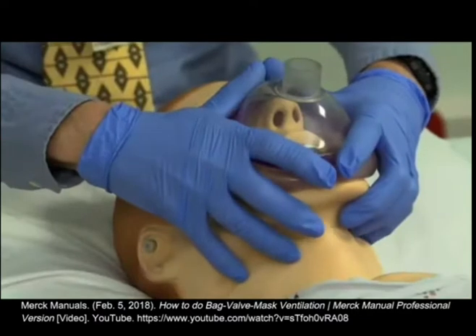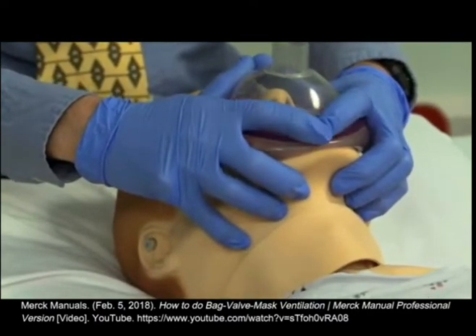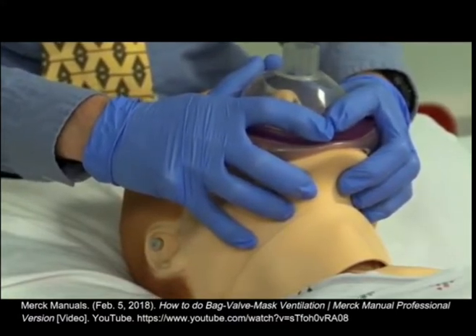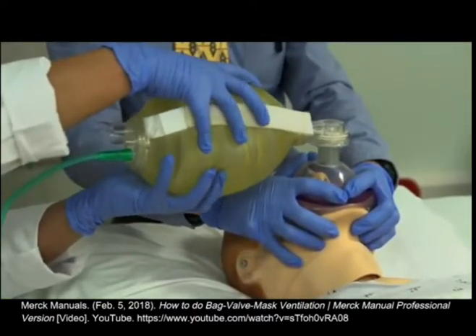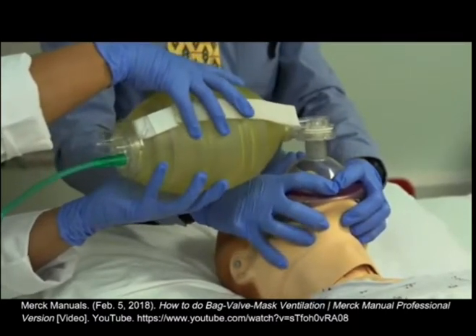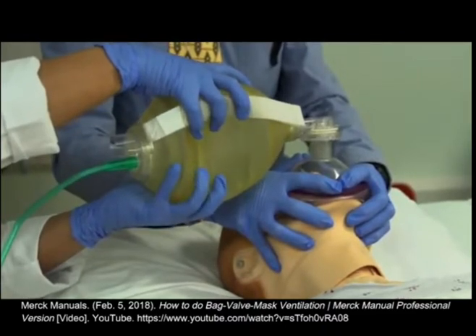The middle, ring, and little fingers are placed under the mandible and pull it upwards. The thumbs and index fingers hold pressure along the superior and inferior portions of the mask. Once a proper seal is achieved, the second clinician attaches the bag to the mask and begins ventilation. Note that the first clinician may provide a head tilt and a jaw thrust maneuver while holding the mask onto the patient's face. Observe for proper chest rise during ventilations.